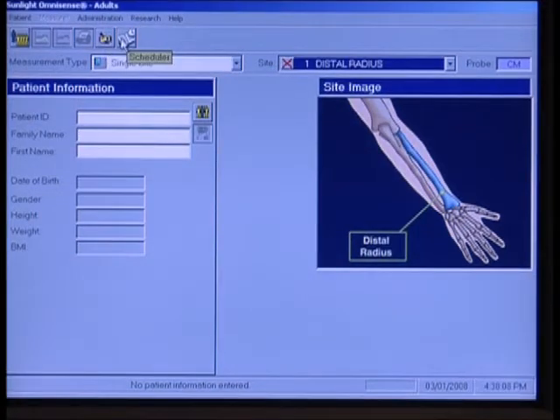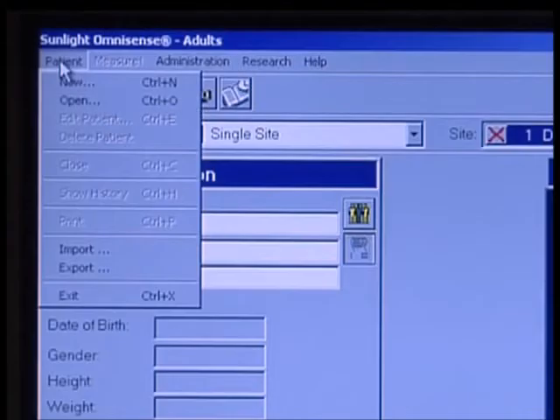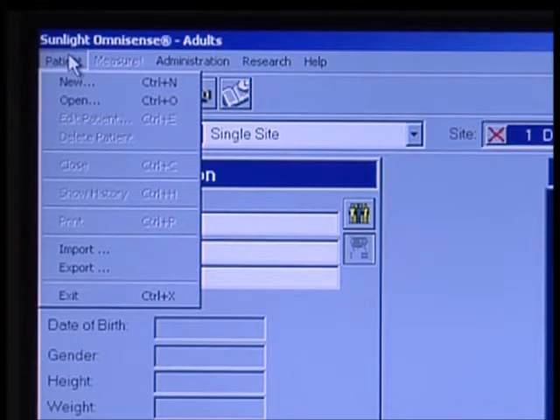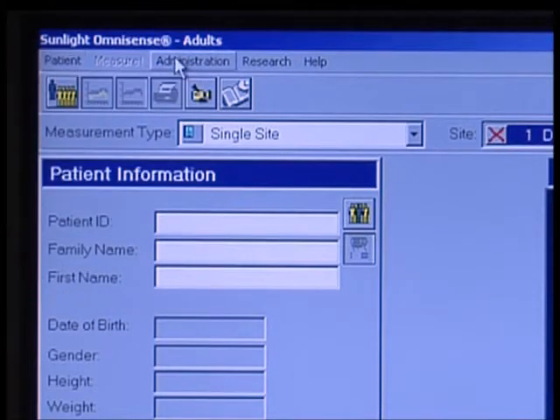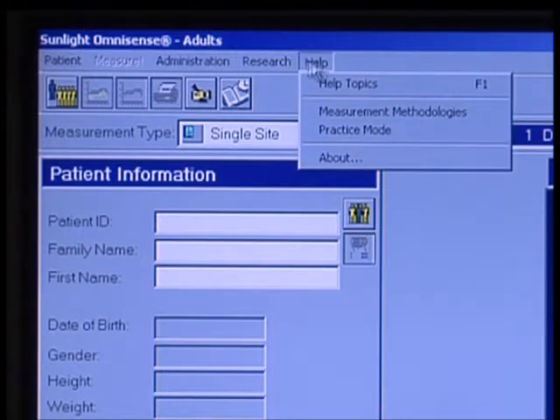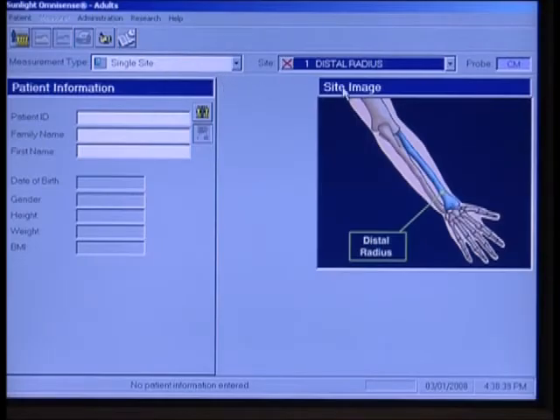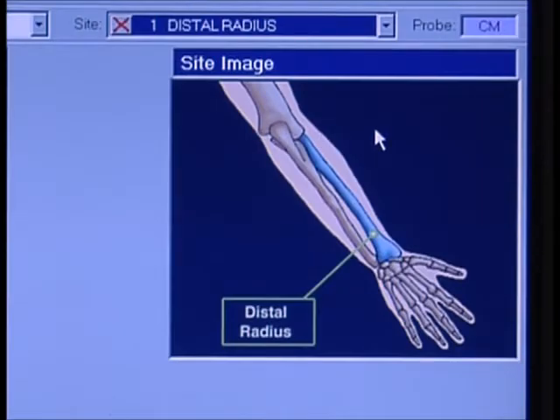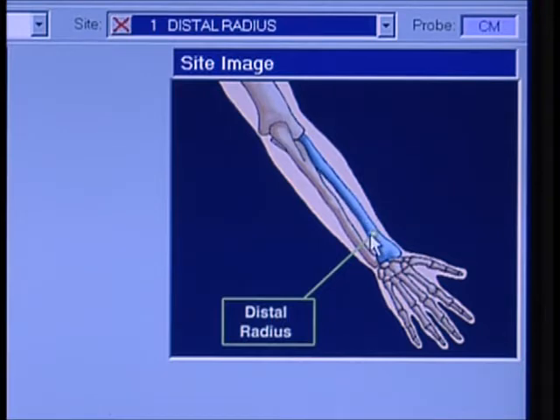There's also a scheduler which we won't be using, and drop-down menus from the top. You can get to a new patient by clicking on this as well, or open an existing patient. We don't have to worry about import, export, administration, or research. There is a help button for different topics you may wish to seek help on. You'll see the site image here — according to whatever site is selected, you'll see the actual area where you're going to be measuring. In this case, we're two-thirds down the distal radius, and this is a picture of where we're going to be measuring the speed of sound.